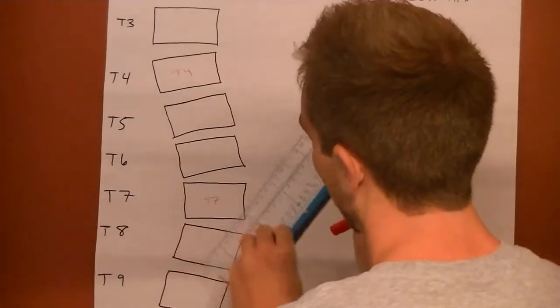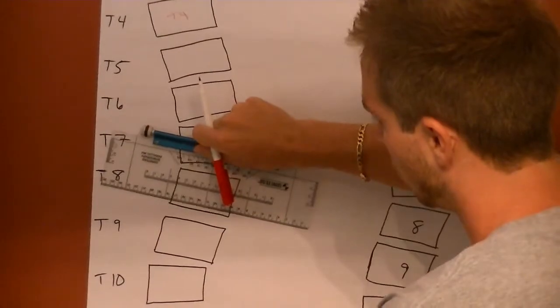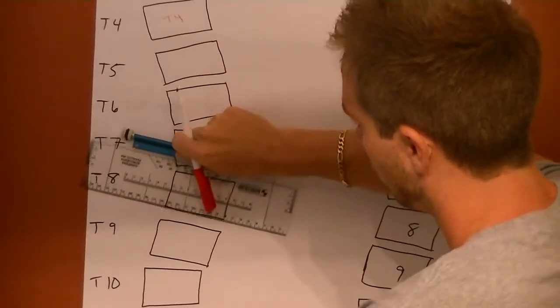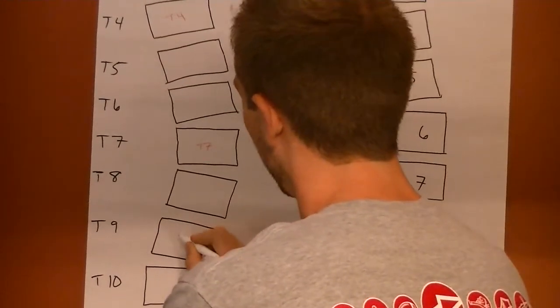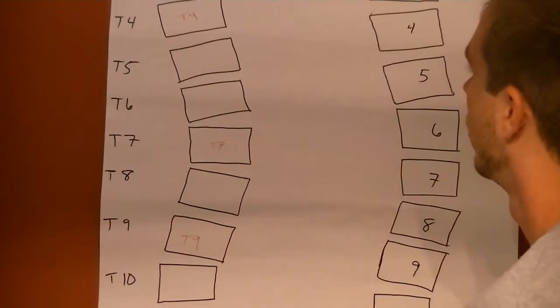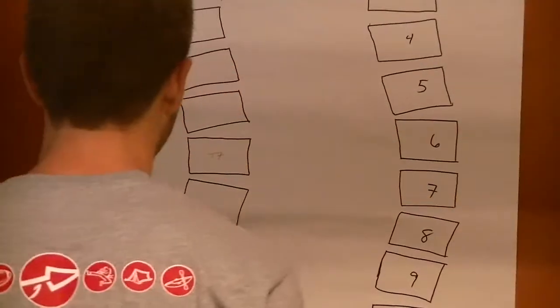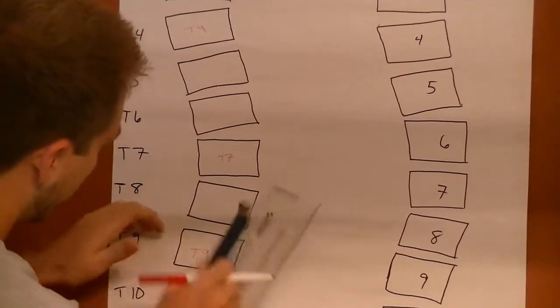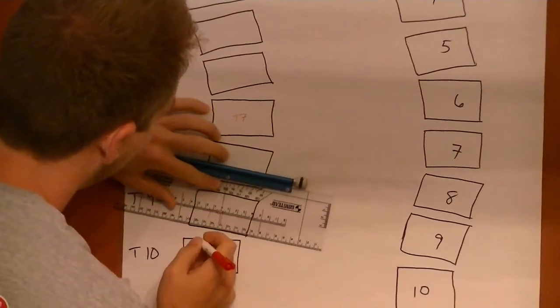Then you do the same thing moving down. I'll move down, moving out here, and all of a sudden it starts to come down and moves back around. This is where we're going to end this one, so that'd be T9. From here, we're going to go to the inferiormost aspect of T9, and we're going to draw out a line.